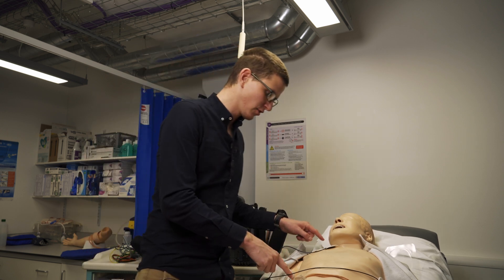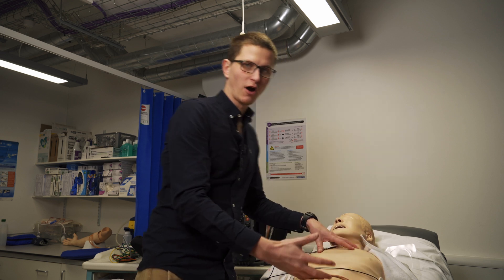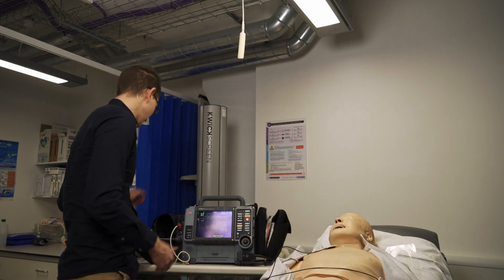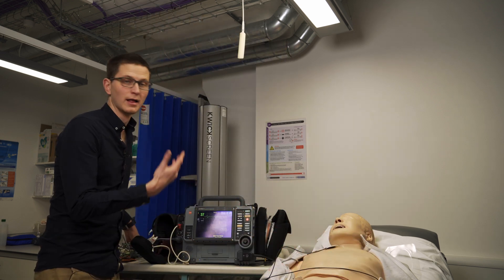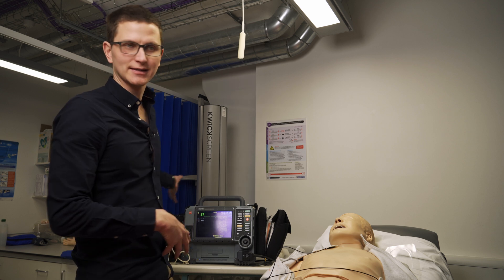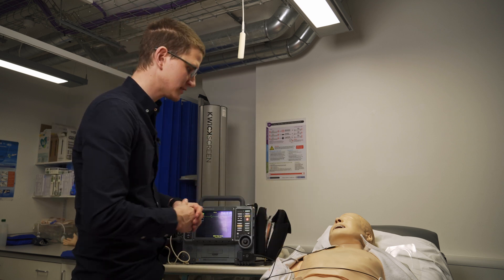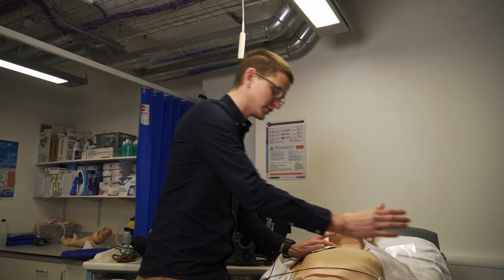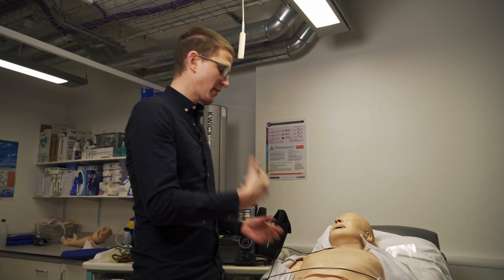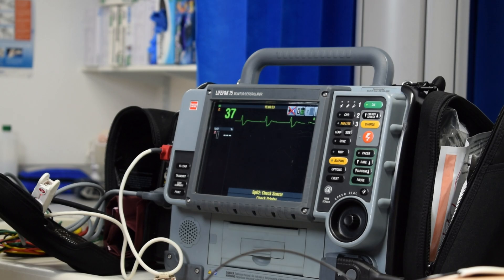What do we need to pace? We need our leads on. The leads are plugged into the rhythm generator at the back. You can't see the leads on the patient, but we also have pads on. So you need leads and you need pads — you cannot pace just through pads.